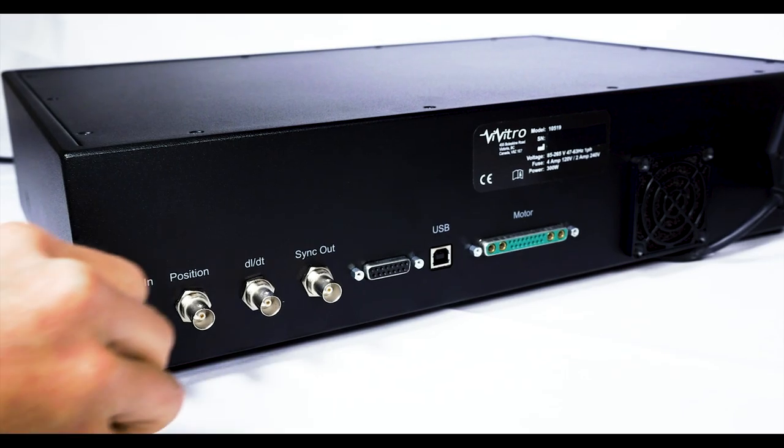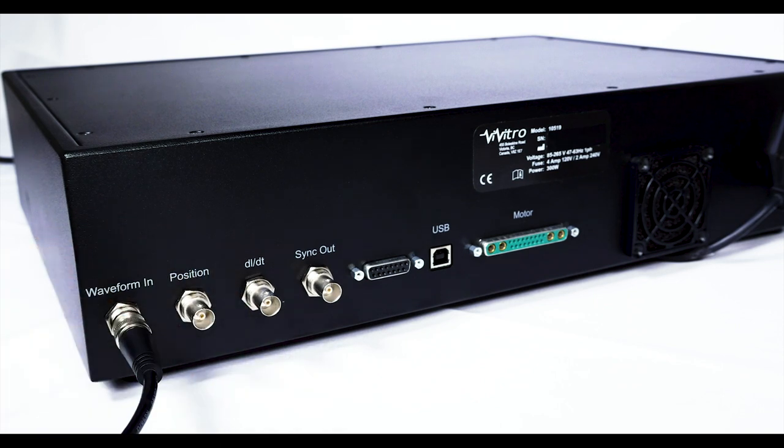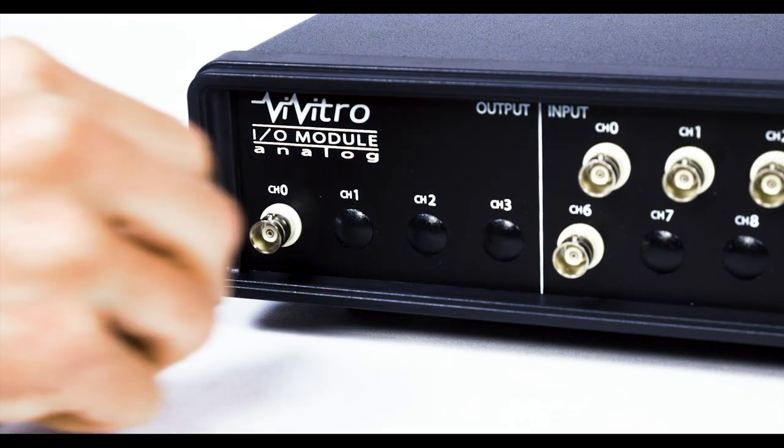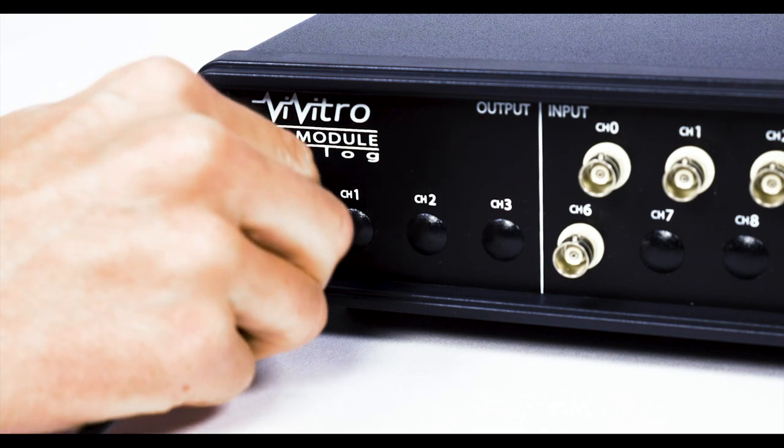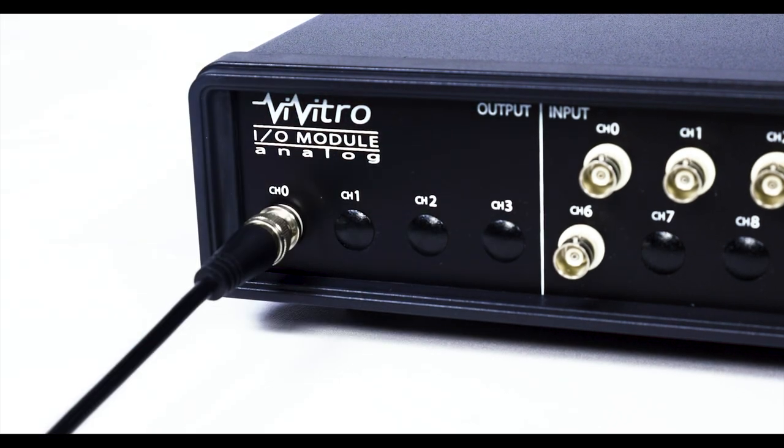The Super Pump can also be driven by an external positive negative 5 volt analog input from a signal generator or other external hardware.